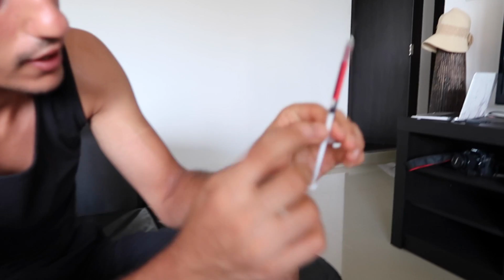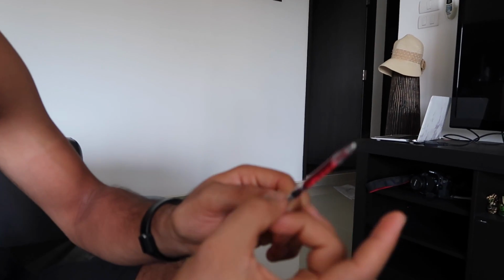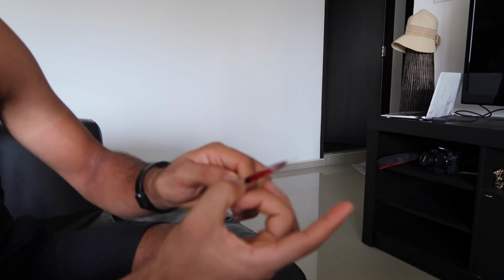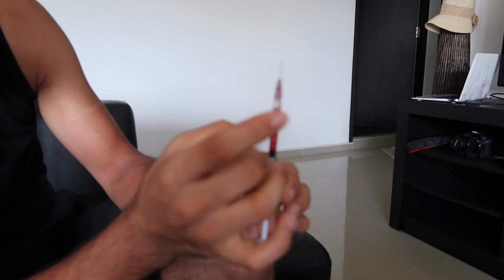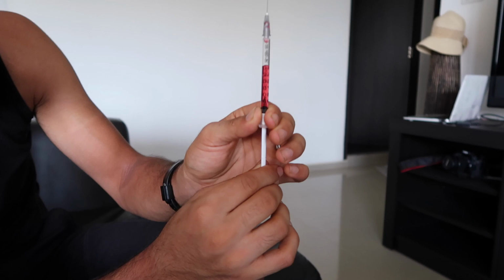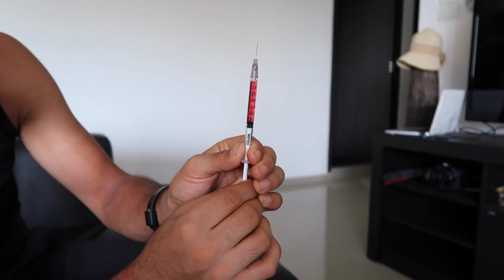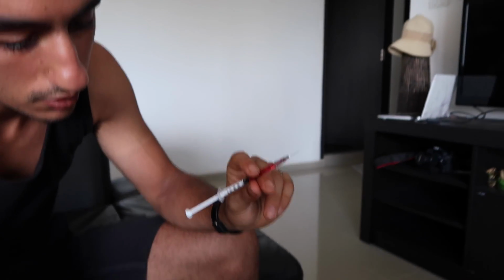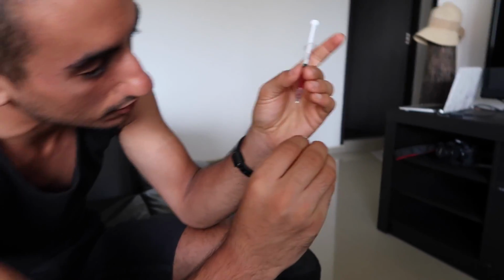Not all of it. So what you can do if you've sucked up a bit too much air, like you can see I have here, is just hit it, so make sure the air goes all the way to the top, so the air bubbles go through. Now we've got air bubbles at the top, suck it up a little bit more, and then squeeze that all the way out, and then continue sucking up the rest of your B12.